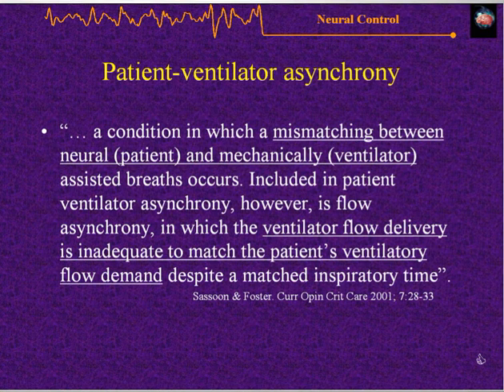This is the most recent definition of asynchrony I could find. It states that it's a condition in which a mismatching between neural and mechanically assisted breaths occurs. Included in patient ventilator asynchrony, however, is something called flow asynchrony, in which the ventilator flow delivery is inadequate to match the patient's ventilatory demand despite a matched inspiratory time. And the point I want to make with this slide is not only is it important to time the assisted breaths with the patient's efforts, but also to respond to the changes in their demand.